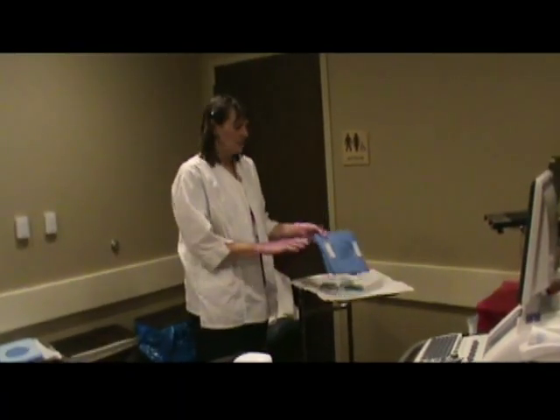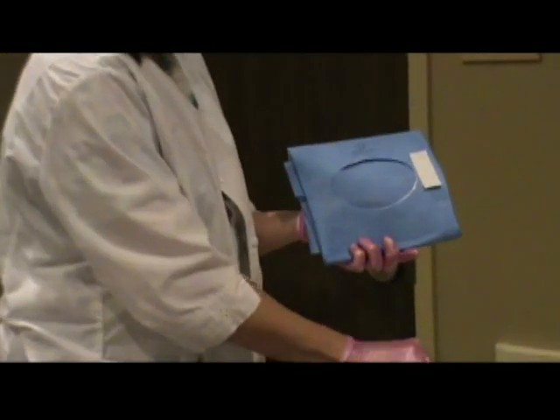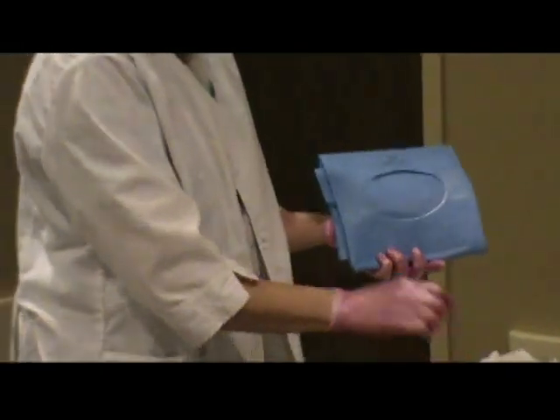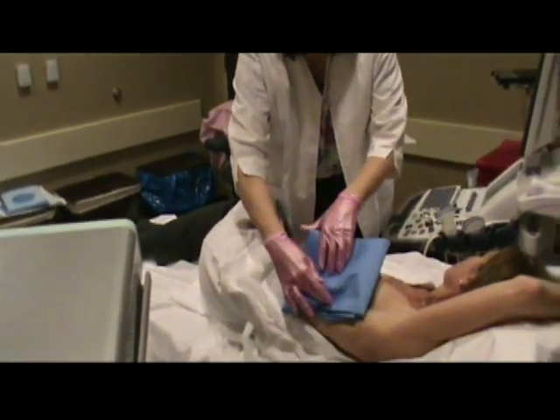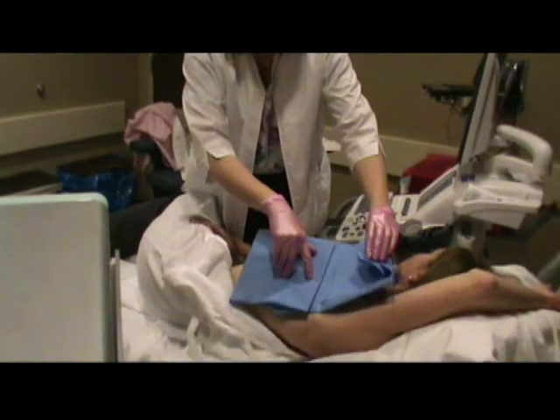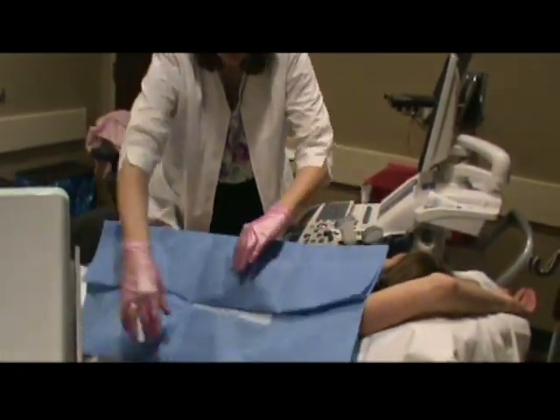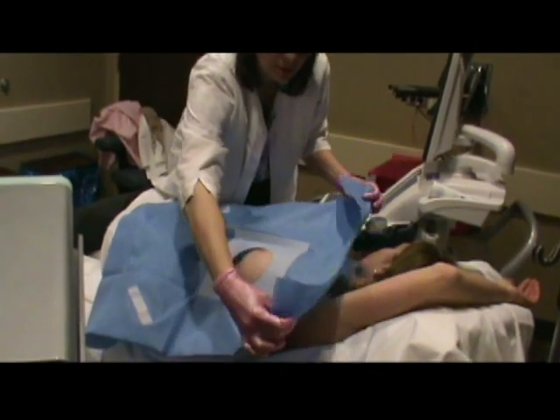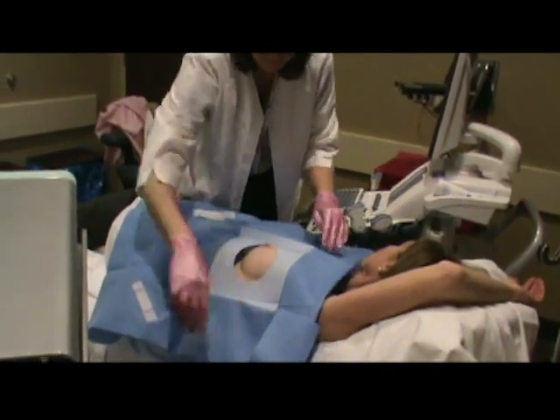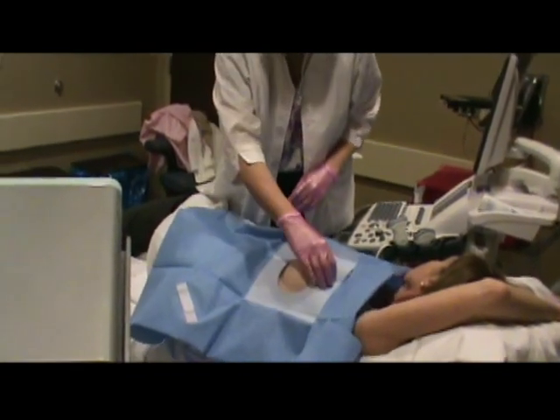Okay, for the second part of the procedure, we're going to take the drape off. We're going to remove the sticky tabs. We're going to place this right on the area that we're going to biopsy, or whatever procedure. These can also be used for cyst aspirations, needle localizations, anything like that. All right, you're going to adhere this right down here.